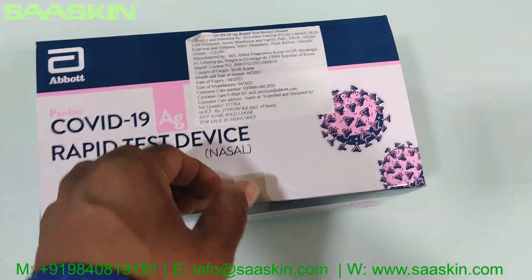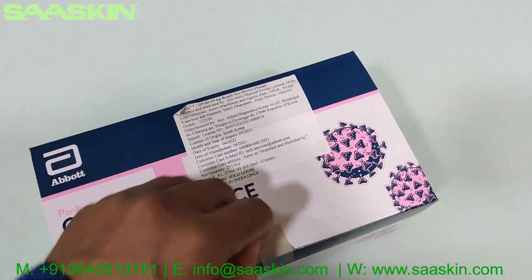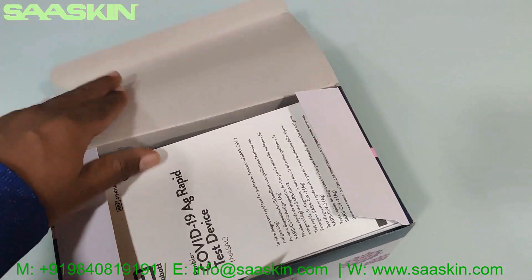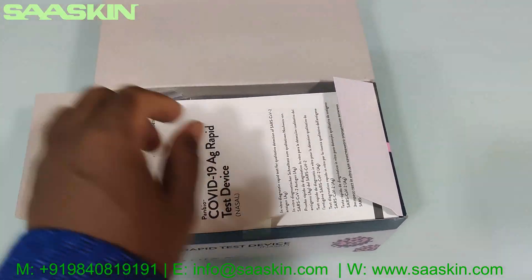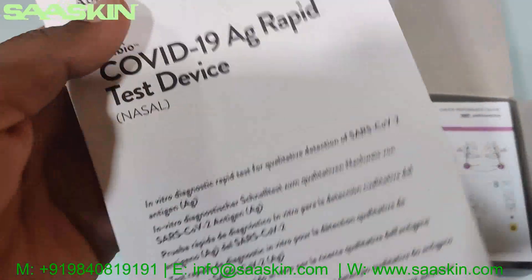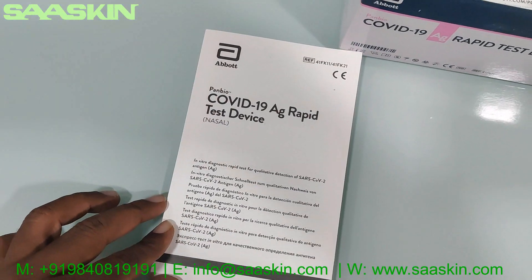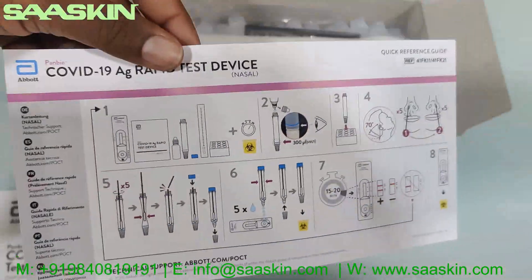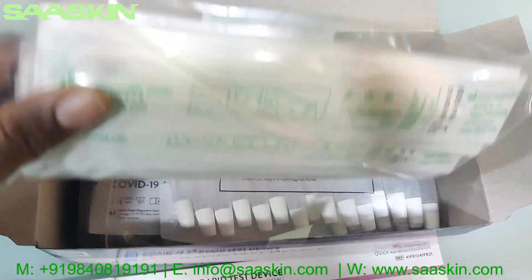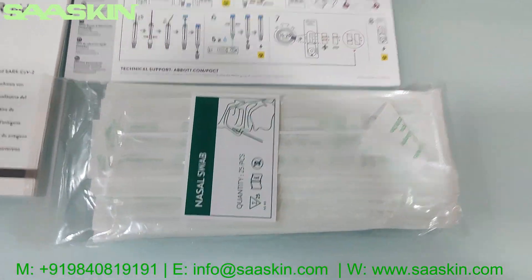I'm going to unbox this and show the contents of the kit. First, you have the ABOT COVID-19 antigen rapid test device product manual — a complete manual — and a quick reference guide with user instructions. You also have 25 sterilized nasal swab sticks.